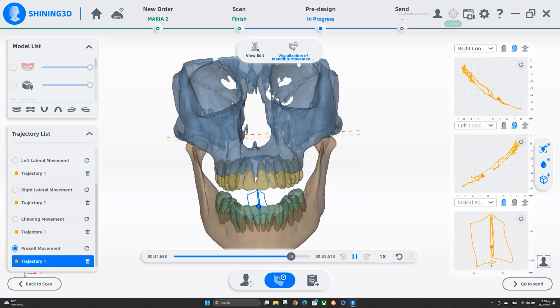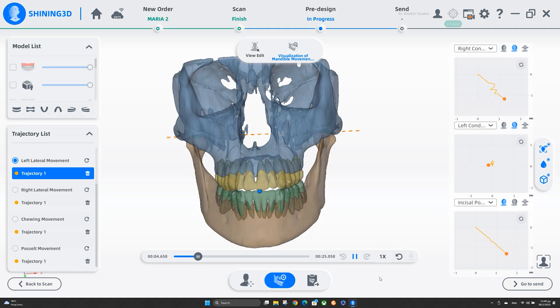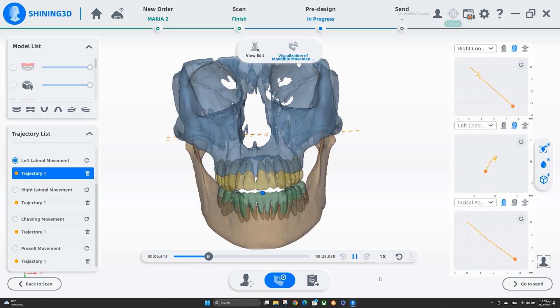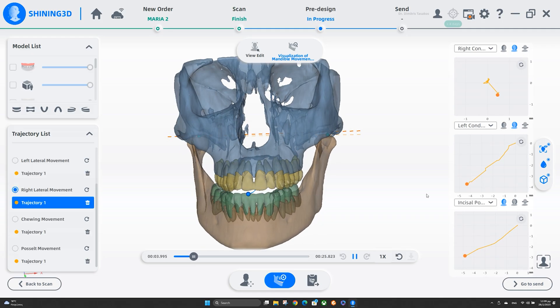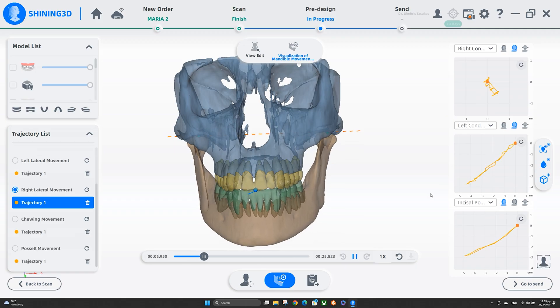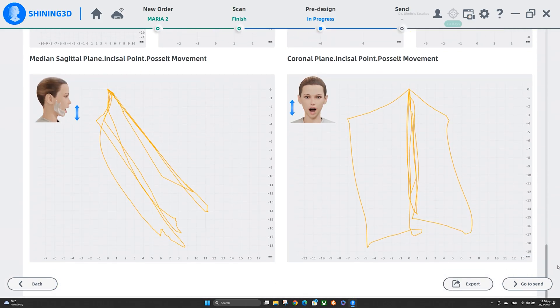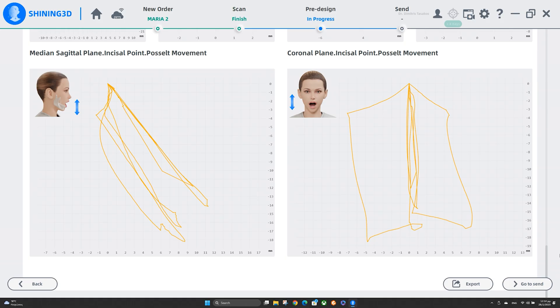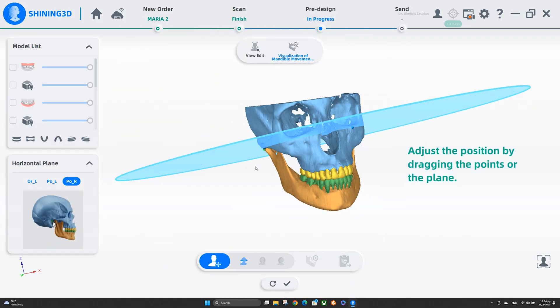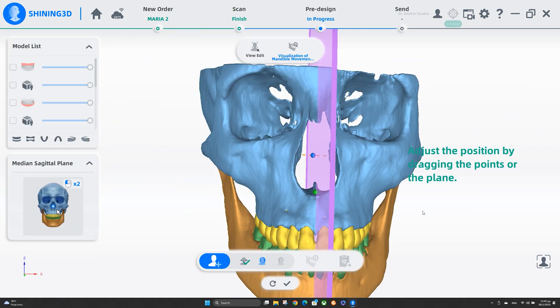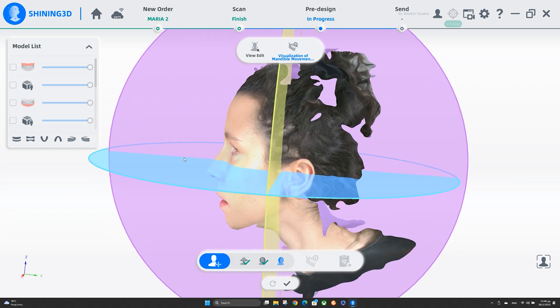With the help of the bone created from the DICOM files, we can define planes — for instance, the Frankfurt plane and other planes, the vertical and the horizontal. We can have 3 planes, and with these planes we can have accurate mounting procedures. We did all this with our facial scanner, the MetiSmile.